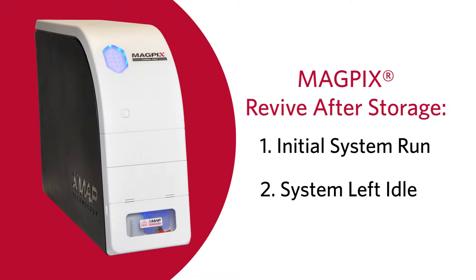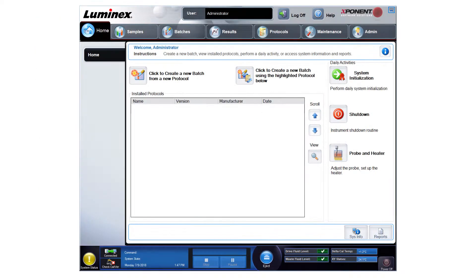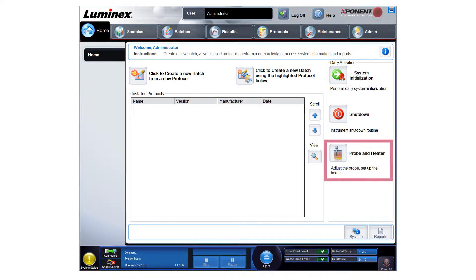Let's go through the steps to run a Revive After Storage routine using Exponent software on the MagPix system. First, ensure the probe height has been adjusted before running the Revive After Storage routine. Refer to the user manual for more information.